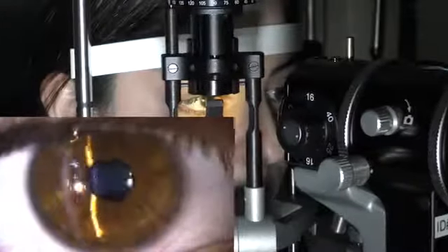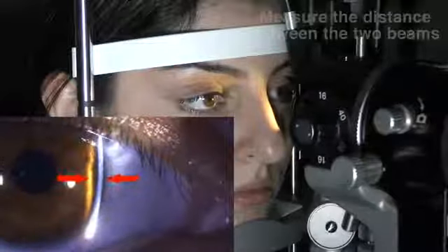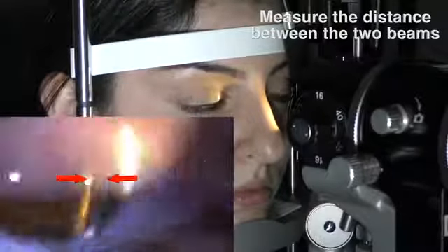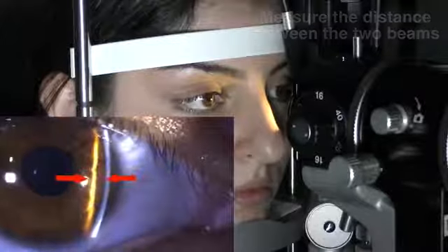The von Herrick method is a way to look at the depth of the anterior chamber. As I swing the light over, I want to compare the distance between the first beam and the second beam. That's the von Herrick method. If I can fit the first beam within the two beams, that means it's one corneal thickness deep, because the first beam is the corneal thickness.